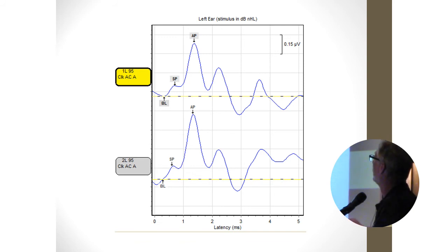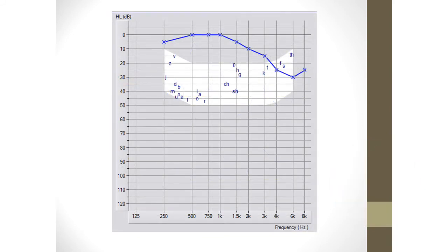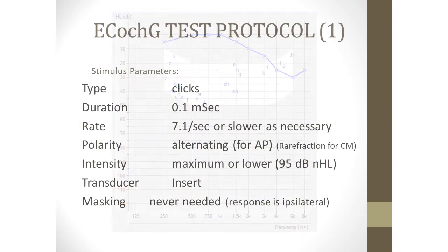But this was very, very easy to do within just a couple of hundred clicks. And couldn't miss the summing potential, couldn't miss the action potential. And did it twice, and very repeatable, and very typical. Even on a patient, I did put my audiogram. There's my audiogram. So not too bad.